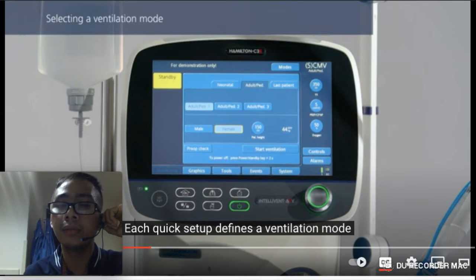Remember that the default of the manufacturer was based on a normal lang. But clinically, we are hooking the ventilator on patient with lung disorders na complicated. So better always to calculate parameters manually, particularly nga sabi ko, yung tidal volume.